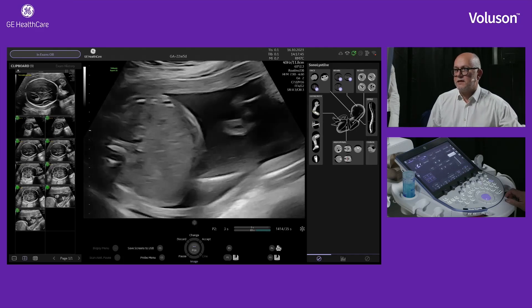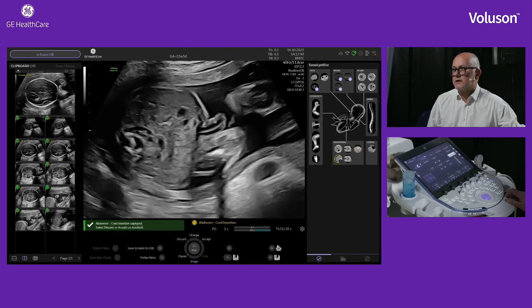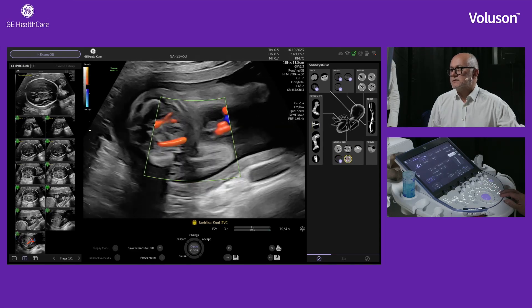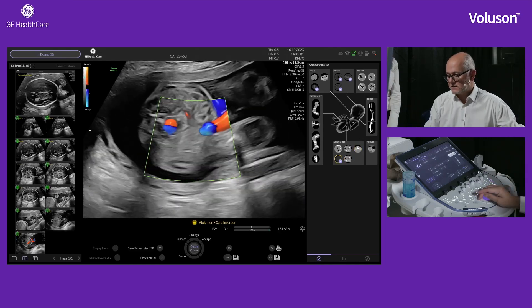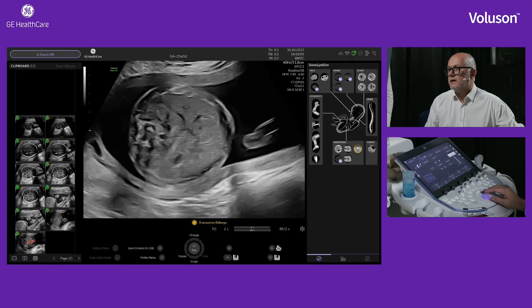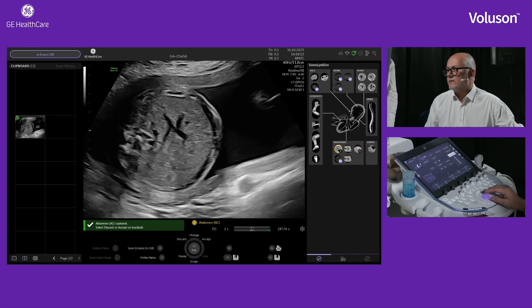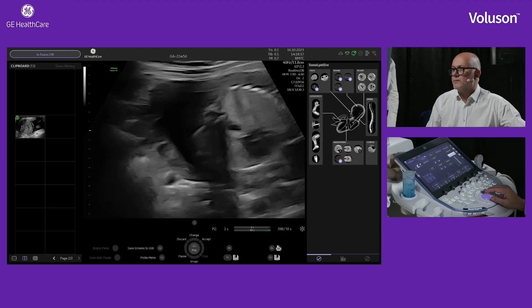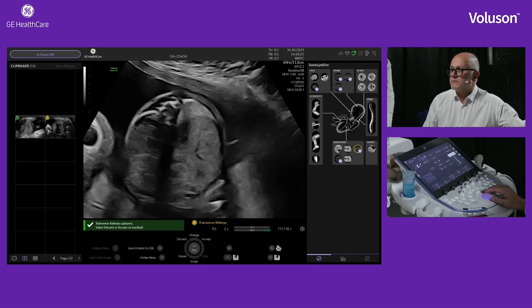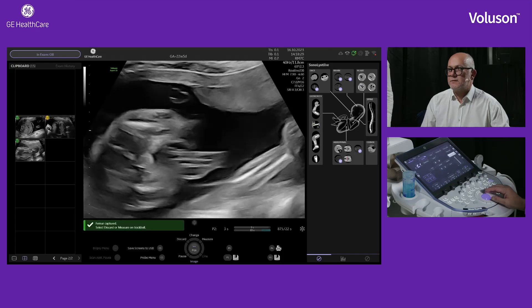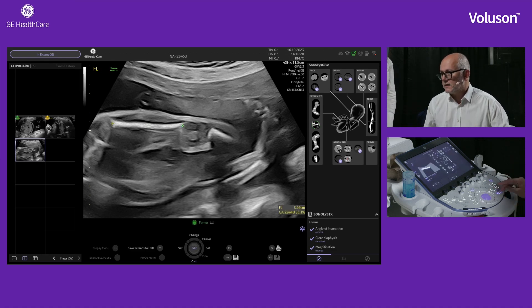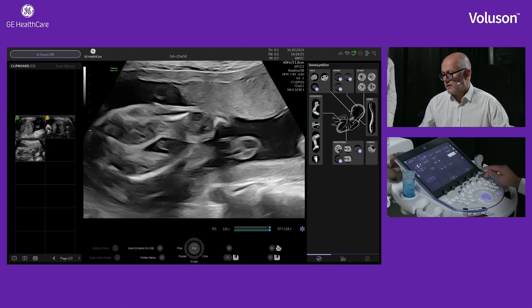Let me go down the baby to the abdomen — there's a cord insertion there. On the right-hand side of the screen you can see that all those abdominal images have already been captured: essentially the abdominal circumference, the kidney views, and the bladder. Coming down to the legs of the baby, capturing a femur there. The femur has been captured and measured automatically, and I can accept that and carry on down the legs.